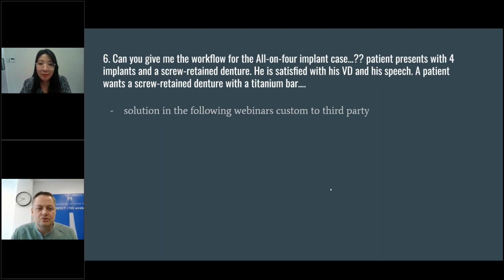You just have to add a maxilla or a mandible with scan bodies on top that you are going to get on position with the Medit design application. Just try using the 3 ways I already showed and extrapolate them to the full arch. I'm going to show in more detail how I do this in the following webinars, but you can already try these 3 ways to get results until then.